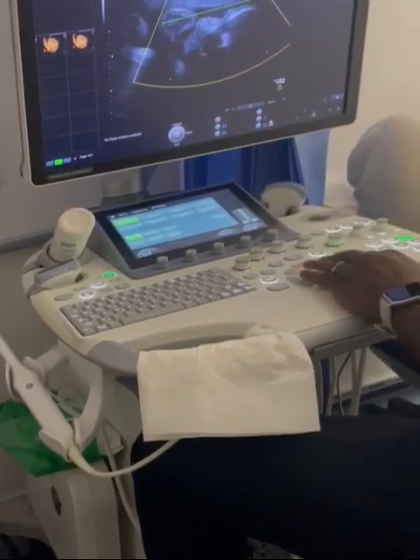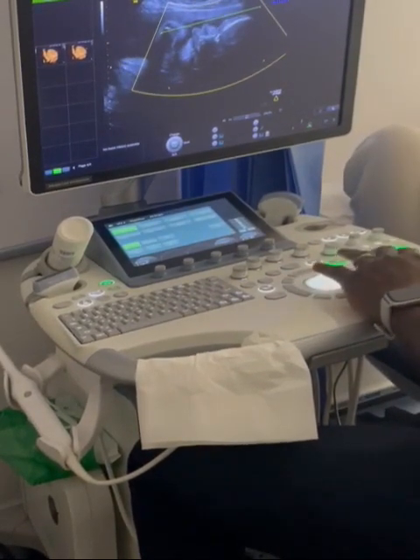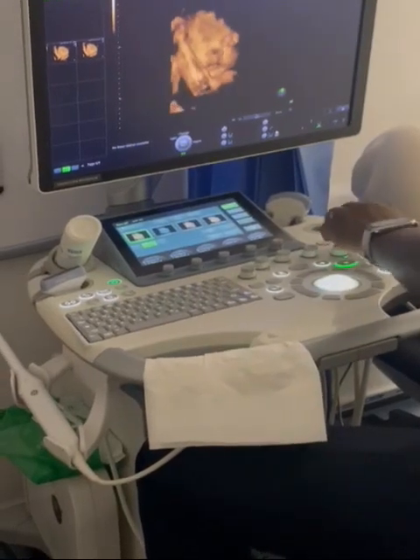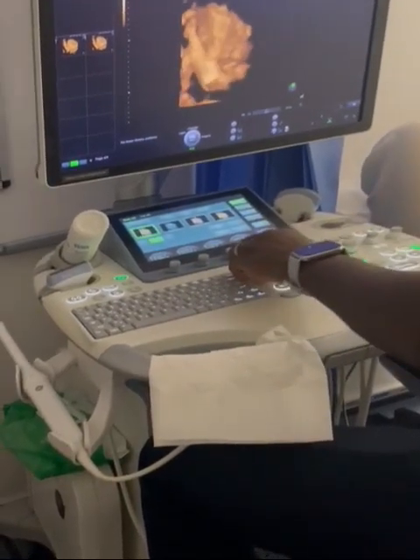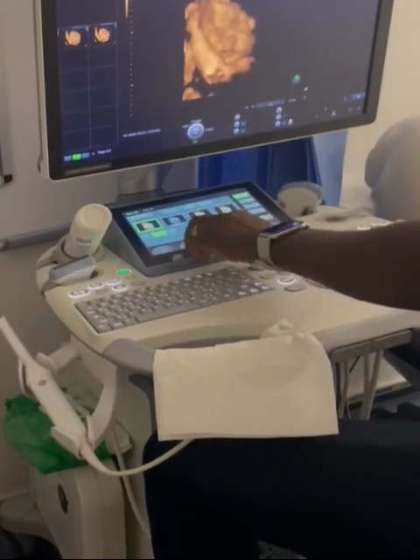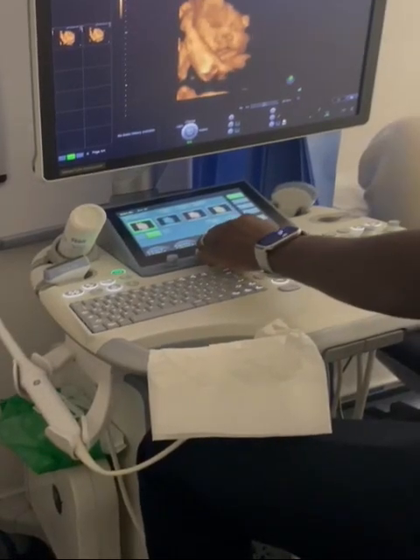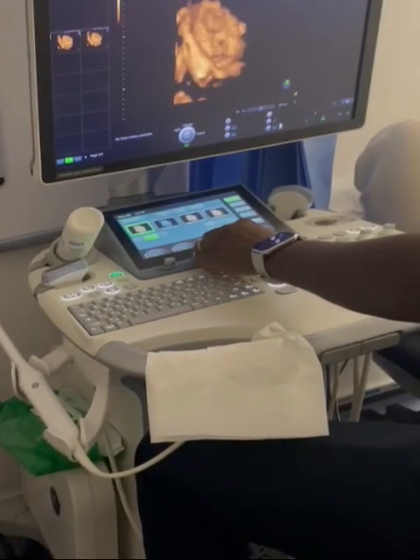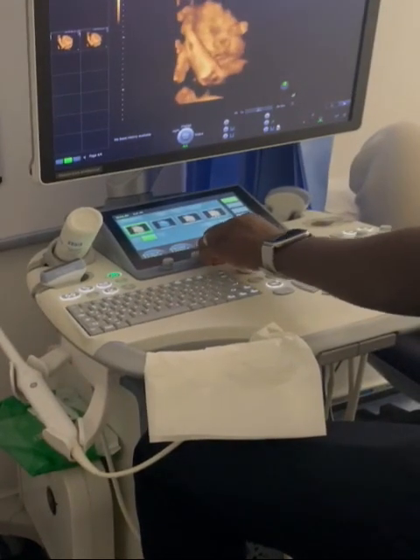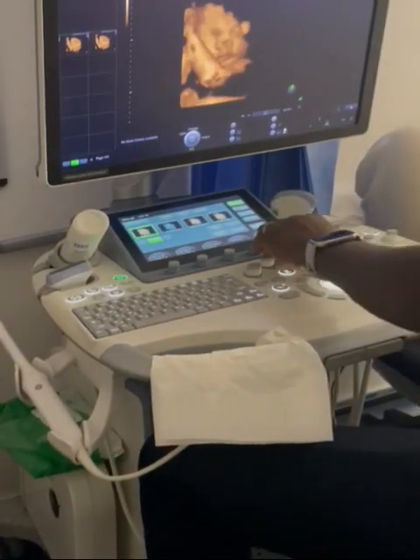So make sure your sensitivity line, the green line, does not cut across the part of the baby. She's so close to that wall now, and that's why we can get a very beautiful picture like we had previously. So you can use this sensitivity line to increase, just take away some things from the face of the baby, you know, and other processing I will do with the video.